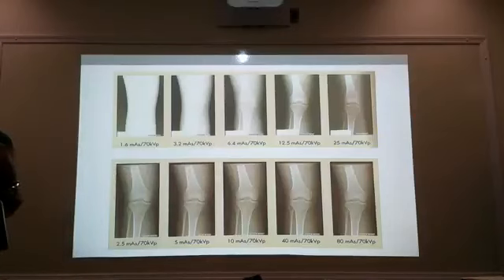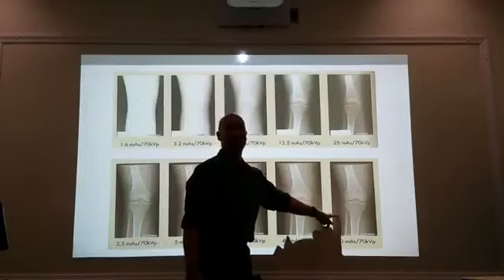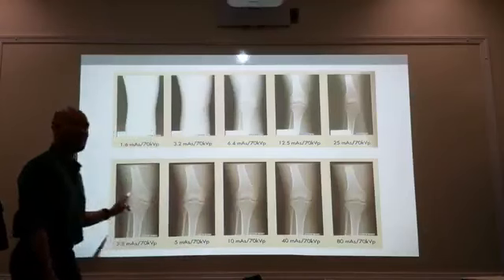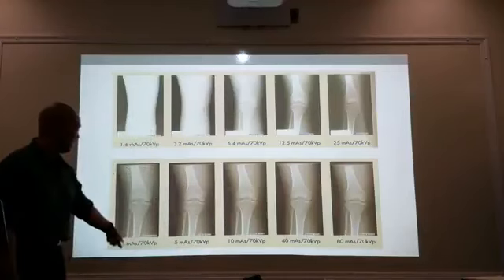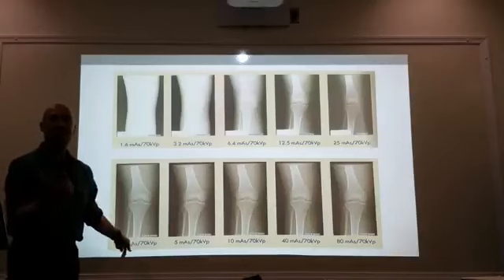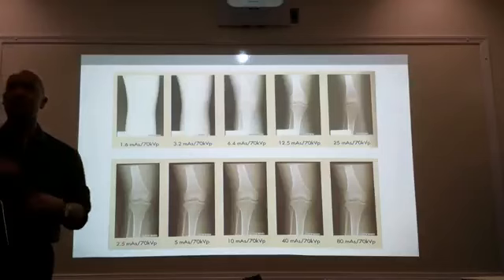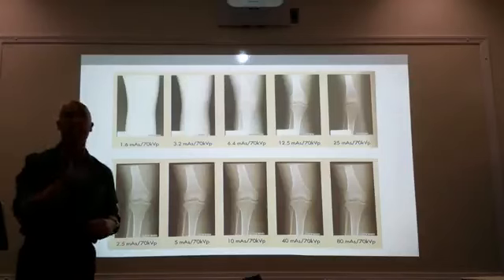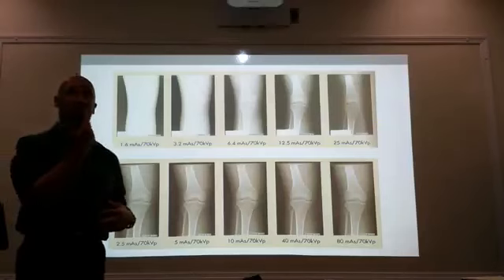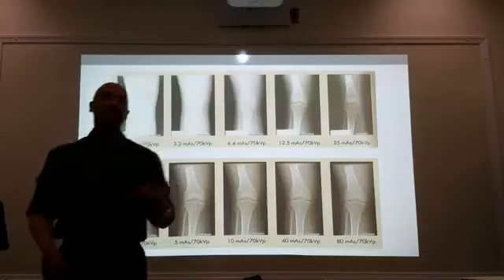Do you understand what I'm saying here? We could be killing our patients and not know it because the images look good every time. Your 80 mAs looks just as good as your 2.5 mAs. So it is our job, not only as a quality control technologist, but you guys shooting the X-rays, to make sure that you set your technical factors appropriately. Don't be so dependent on your X-ray machine and computer that you think my image is going to come out good all the time. This is what happens.